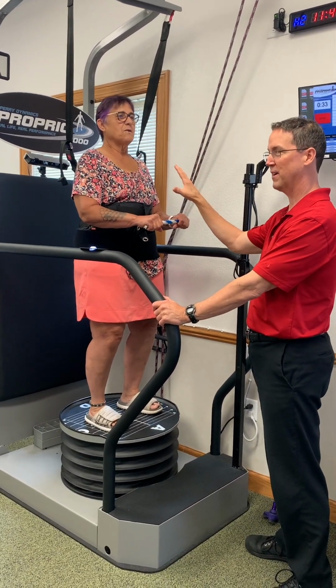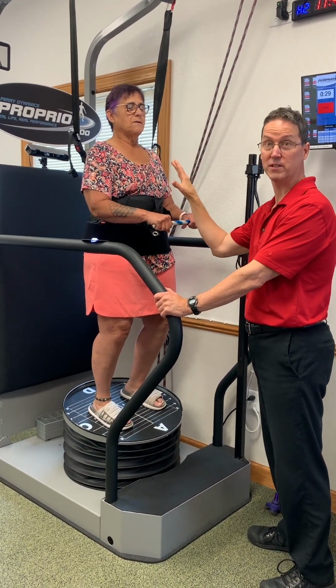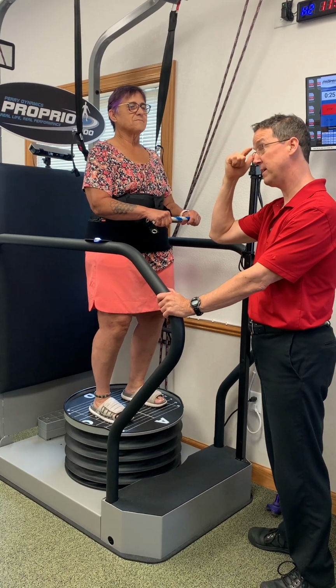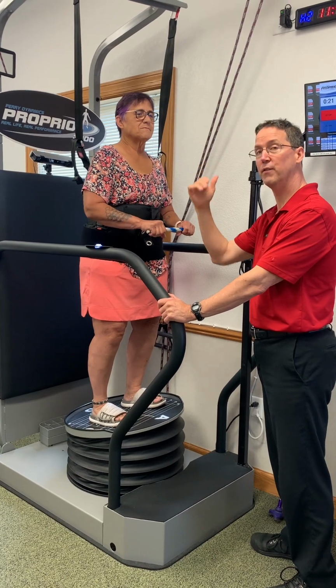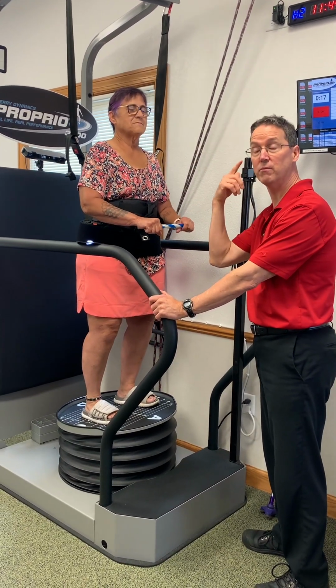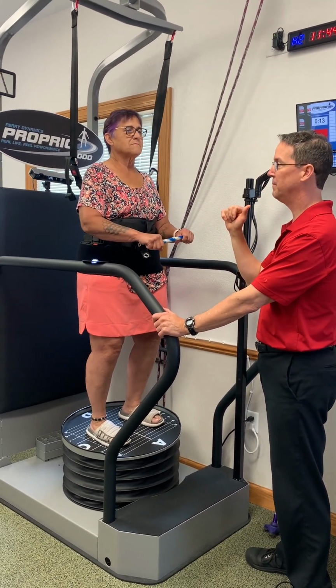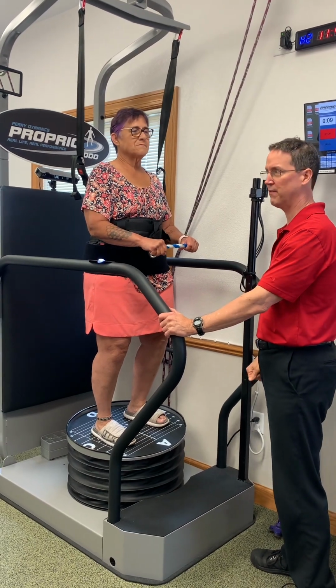If she closes her eyes, obviously that's going to really challenge her system. That's where the money is for a lot of people, because if they're eye dependent, if they're always using their eyes to compensate for lack of full sensation in the feet, lack of full integration of movement in the brain, whatever it might be, then they're more vulnerable. Most individuals are eye dependent for balance.